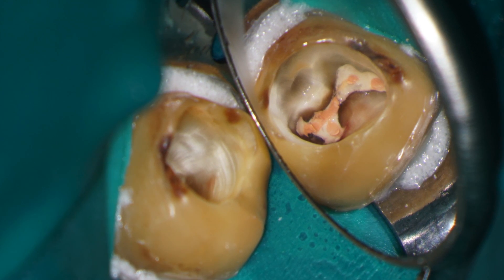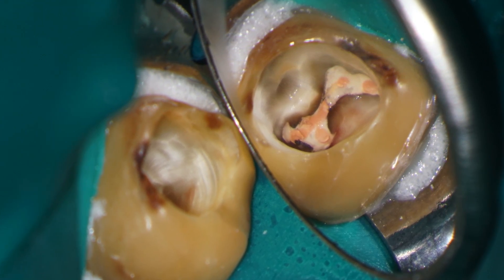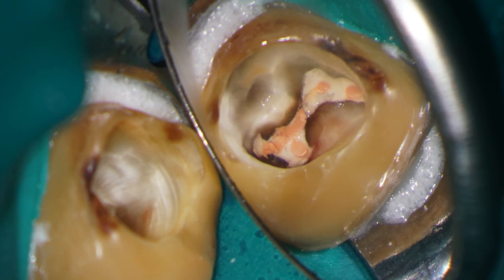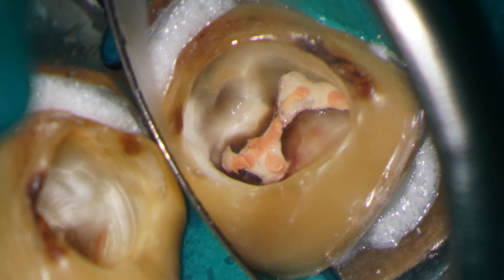Looking under the microscope you can see that I've removed the temporary restoration and you can now see the gutta-percha points surrounded by bioceramic sealer. The gutta-percha points are removed first and a glide path created. When the canals are tapered, most of the bioceramic sealer will be removed.